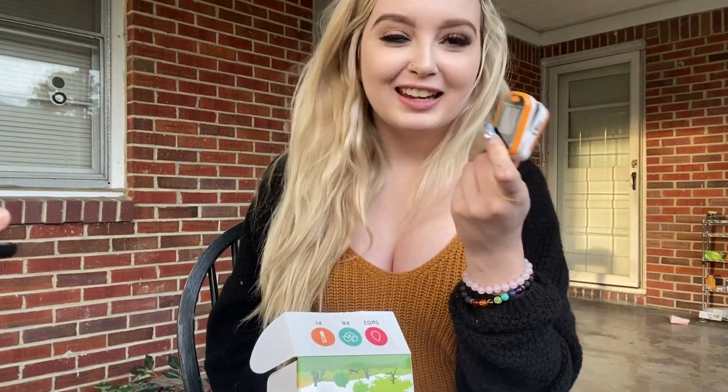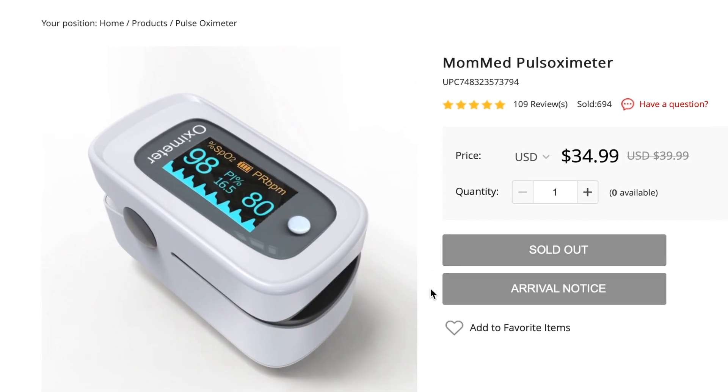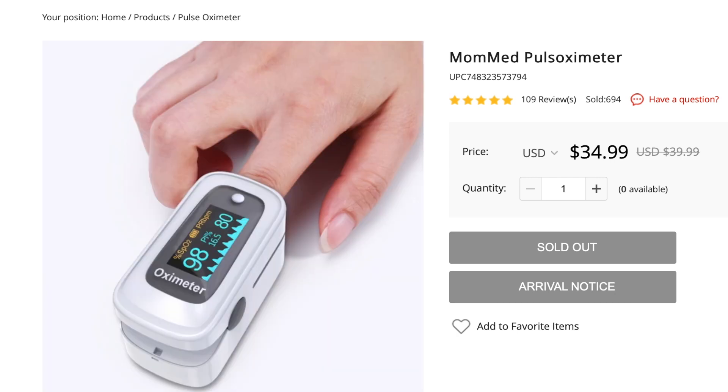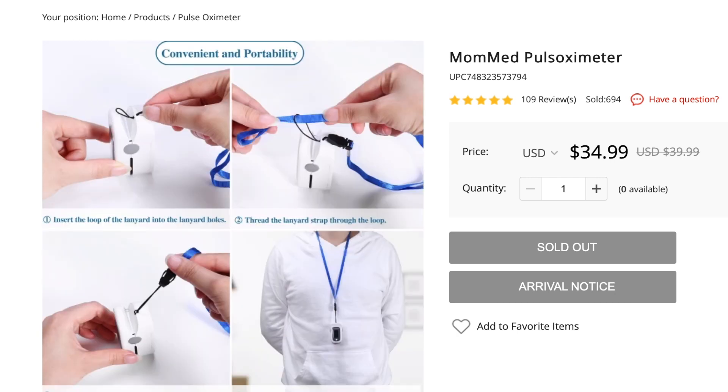This nifty little tool right here is a device that's used to measure the oxygen levels in your blood, specifically in arterial blood, without using any invasive means — so it doesn't hurt. This device also can measure your heart rate.